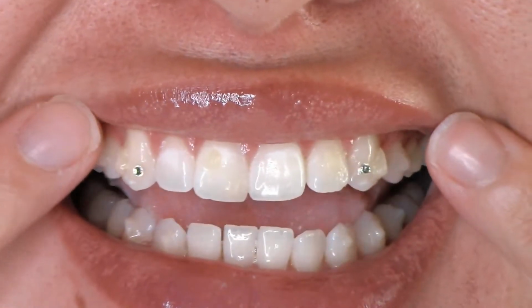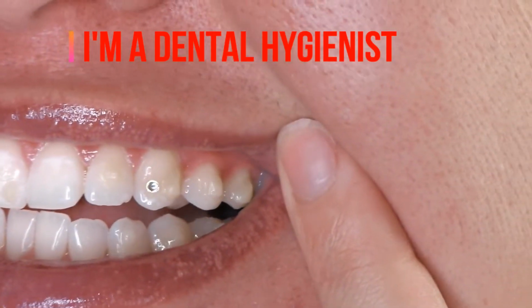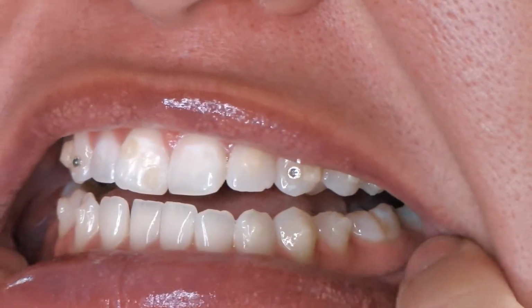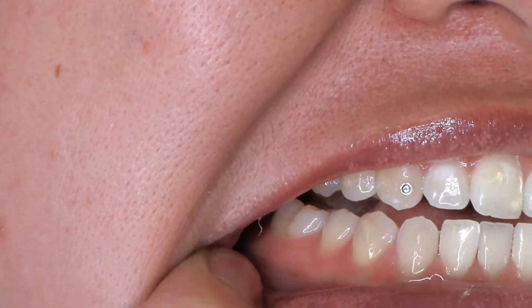Let me zoom in so you guys can take a look at the attachments. Sometimes when I go to work, I do notice some people's attachments get brown stainings if they're coffee drinkers, or maybe even a more yellow toned stain. But I've tried my best to brush my teeth and keep my attachments really clean because I wanted to avoid getting those stains. And I think I'm doing a pretty good job.